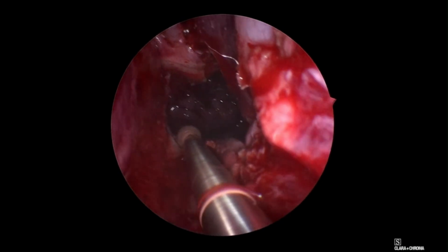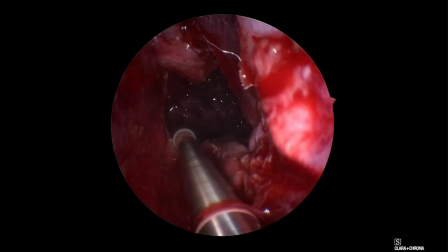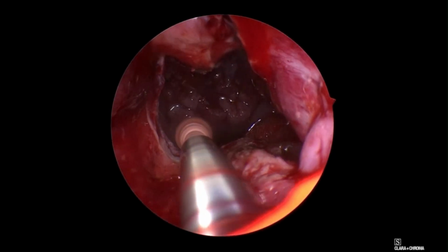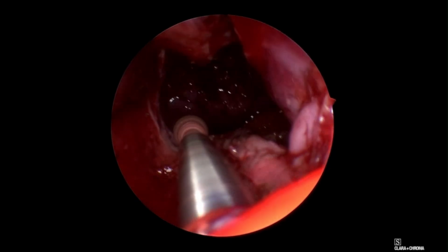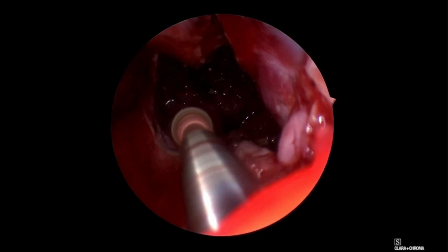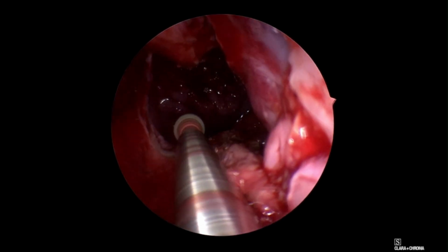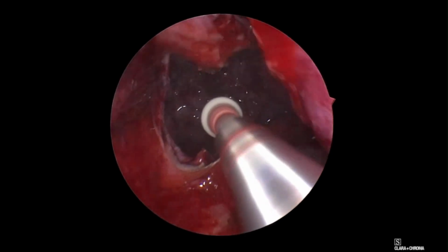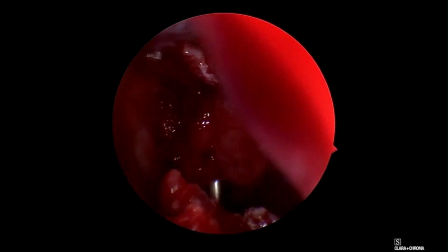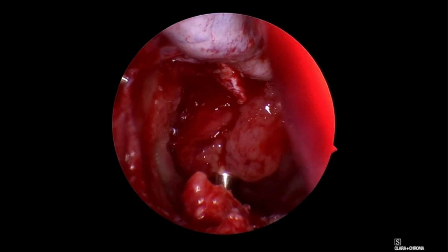I again used the drill to smoothen the region. We should go from medial to lateral. We should not go too lateral towards the pterygoid, otherwise the patient will end up having trismus. We get a nice smooth cavity.